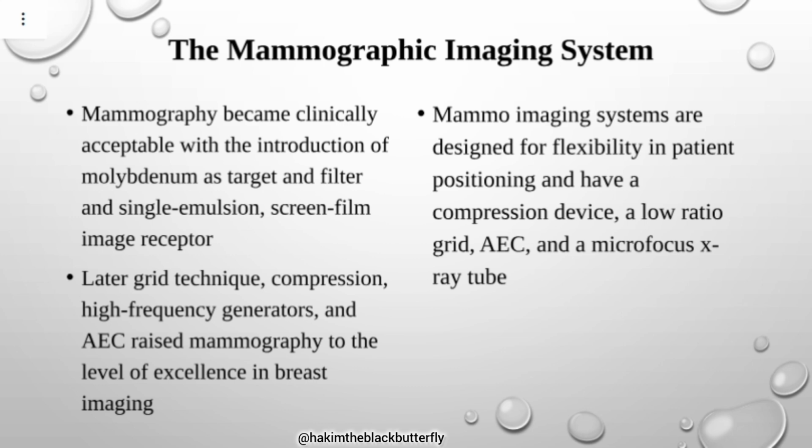So the mammography imaging system: mammography became clinically acceptable with the introduction of molybdenum as a target and a filter, and single emulsion screen film image receptor. I know you have been doing that assignment which I gave you for the screen film radiography. You realize that the films used for conventional radiography are double emulsion, but for mammography, with screen film radiography, they use single emulsion. It is for a purpose. You can read more about it and know why.